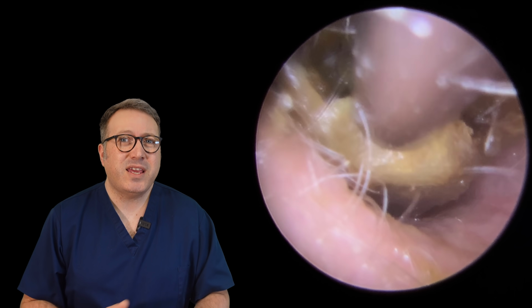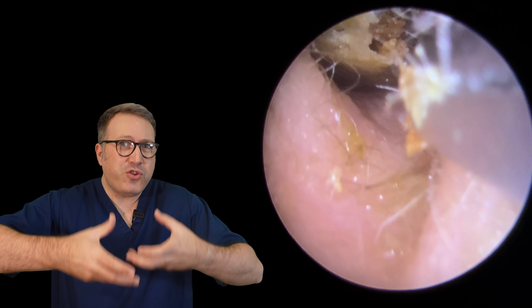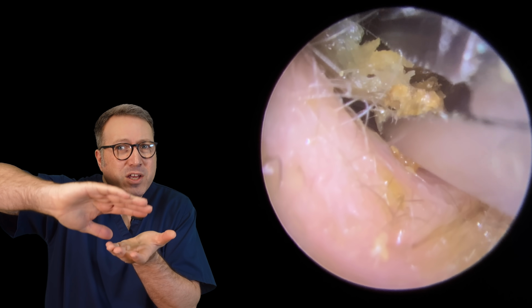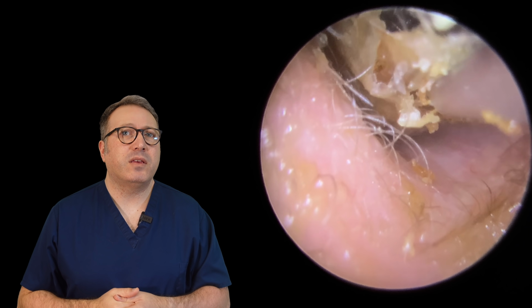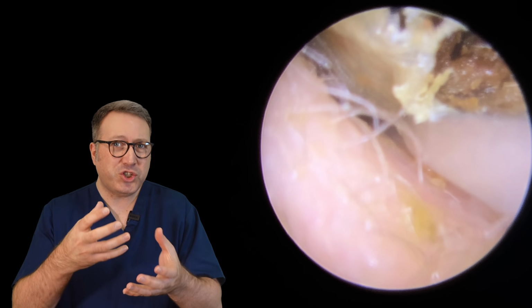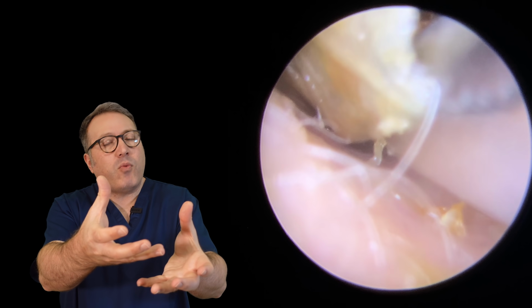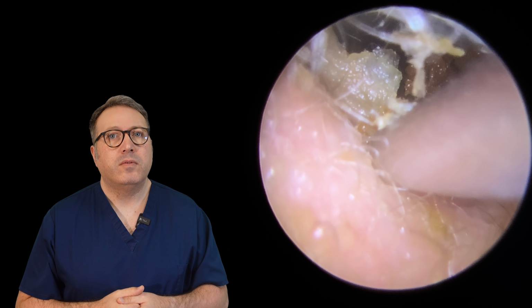You can see we're trying to hold on to the skin. What I'm trying to do is turn the wax. I'm trying to lift from the base so it effectively scoops the wax upwards as well, just to try and draw this down. But you can see every time we've gone in with the crocodile forceps, although it shears, it does draw the wax and the skin that little bit further down the canal.